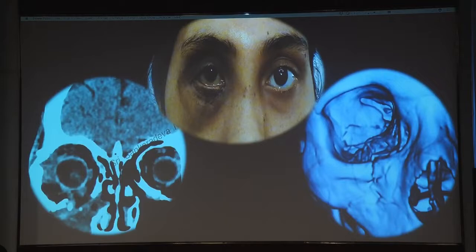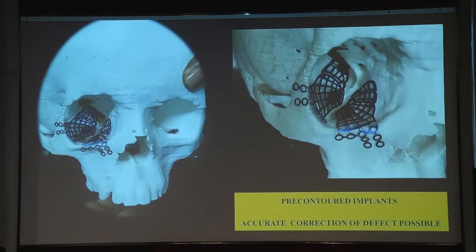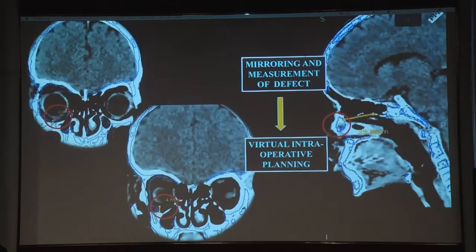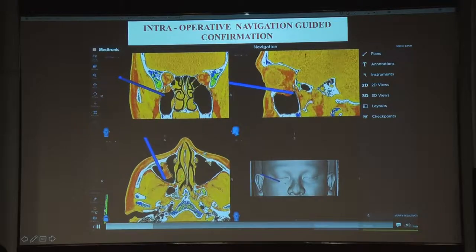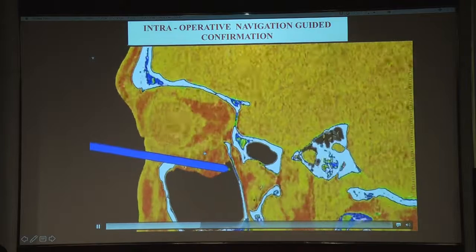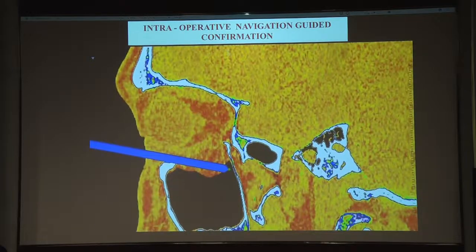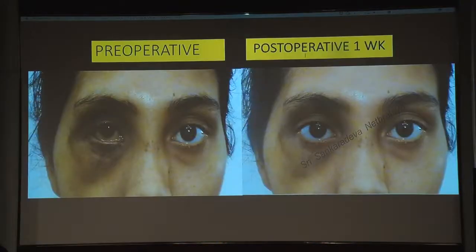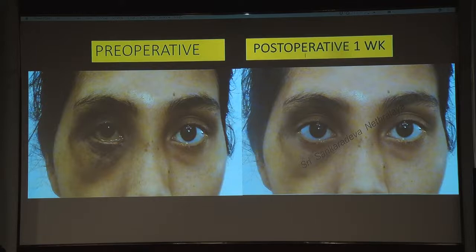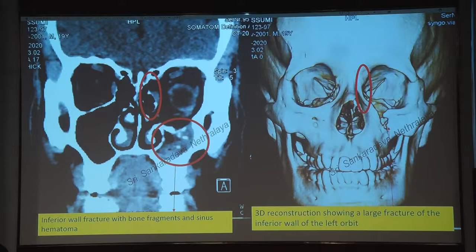Another case is this lady with a bad fracture — 3D printing was done pre-operatively showing a lateral wall fracture and inferior wall fracture. During the procedure we measured the defect and determined implant thickness. Navigation shows the endpoint of surgery as an advantage of this system. Post-operatively the result looks almost symmetrical with the other side, and even in late scarred cases, with proper planning you can achieve good correction.